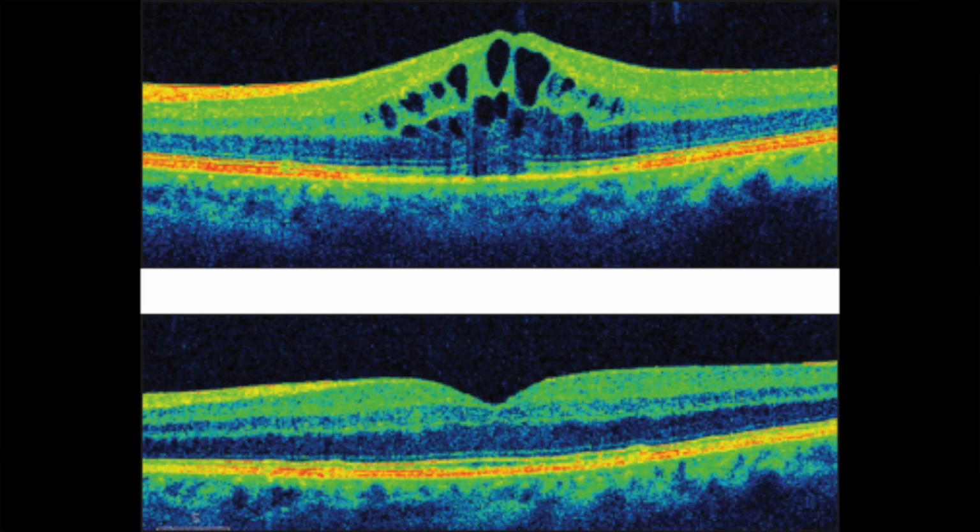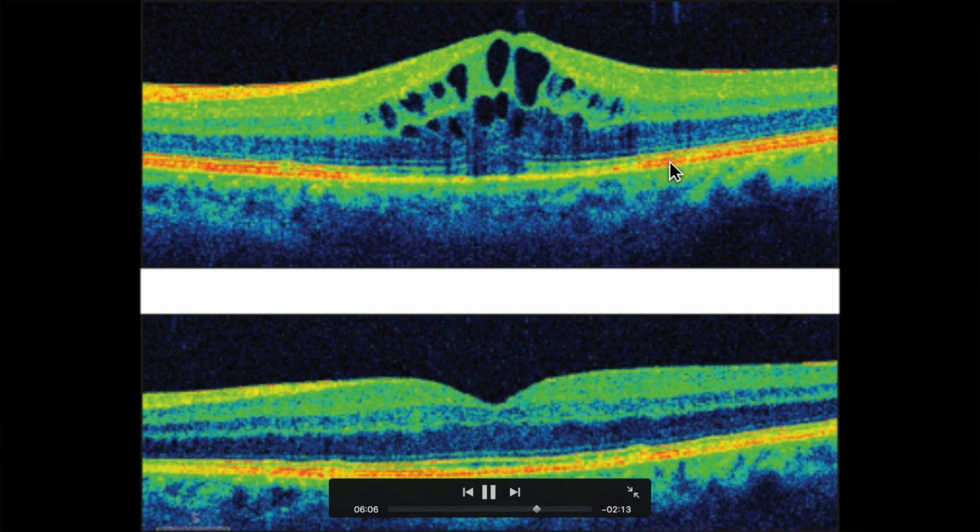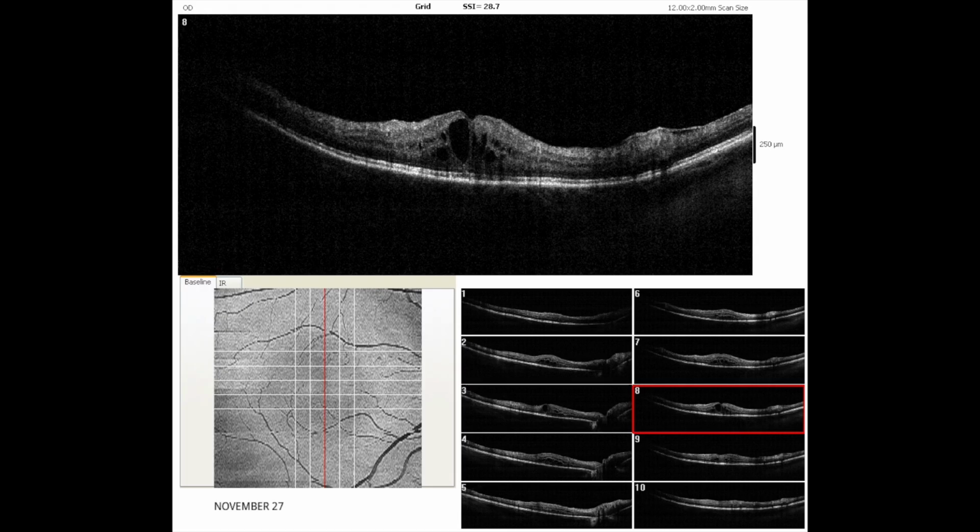When we talk about macular edema, this area of the fovea starts to build up fluid, and you'll get little pockets or cysts of fluid that develop in the foveal area and start to elevate and cause this tissue to swell. The normal thickness of the macula, in this picture, is about 250 microns. That's 0.25 millimeters thick. This particular image is an image of my eye before I had some treatments for the macular edema.